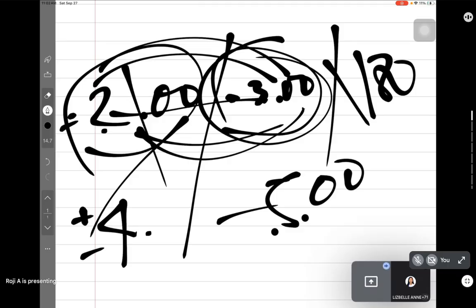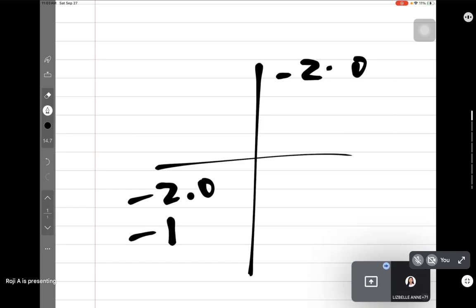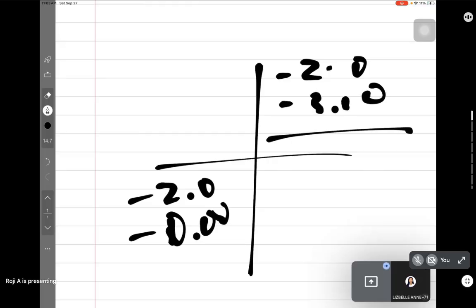So in effect, another way to do it is the cross. So you would notice minus 2 on both meridians, but this is axis 180, meaning to say 180 will get 0, while this one will get minus 3. So 90 will get minus 5.